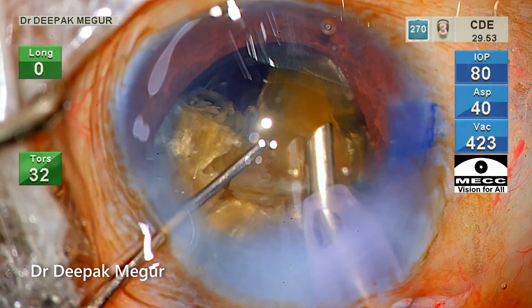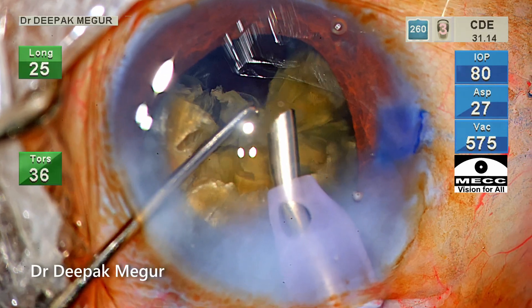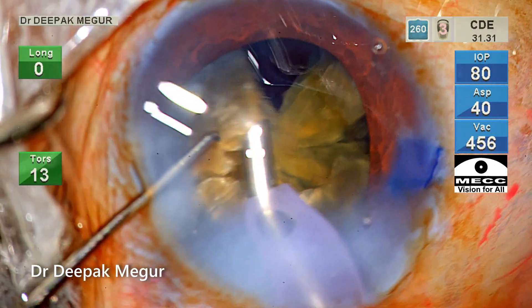The judicious delivery of power is going to decide how much lens chatter we are going to have, and that is controlled by your foot pedal because the power is set linearly.